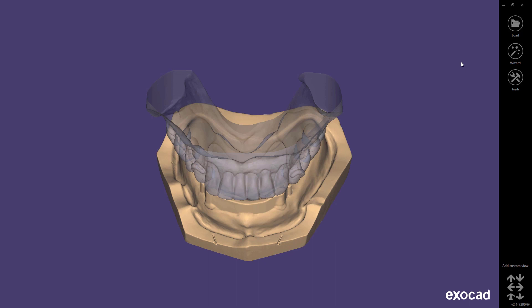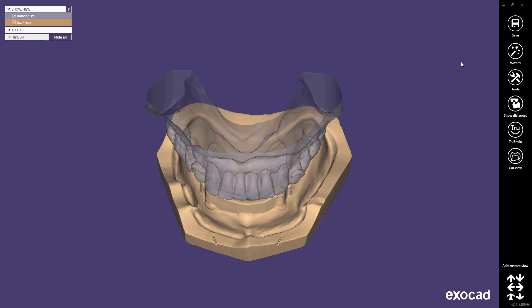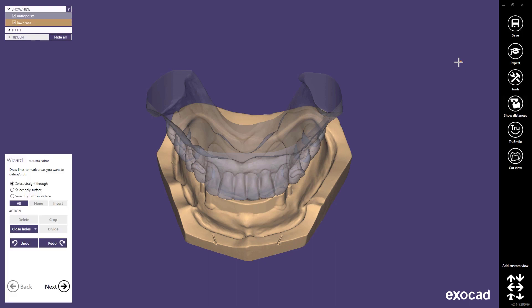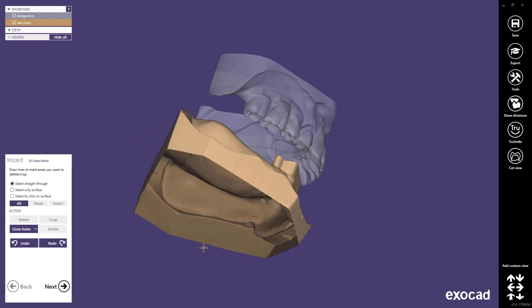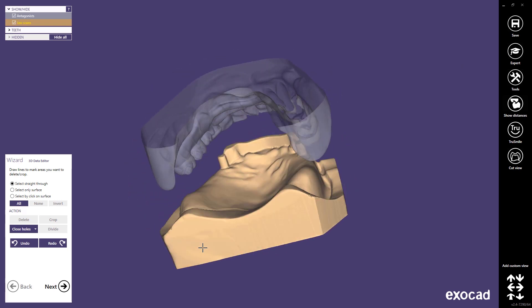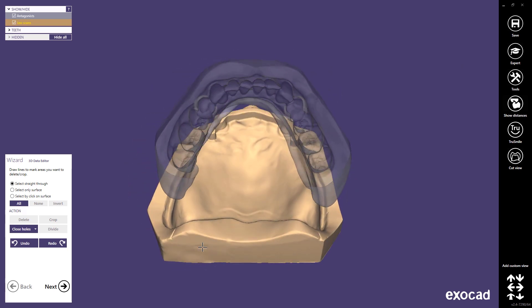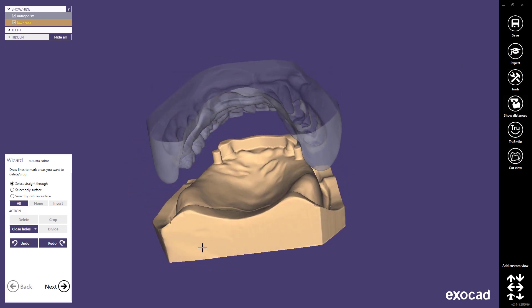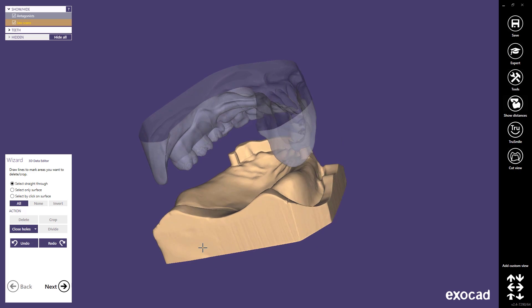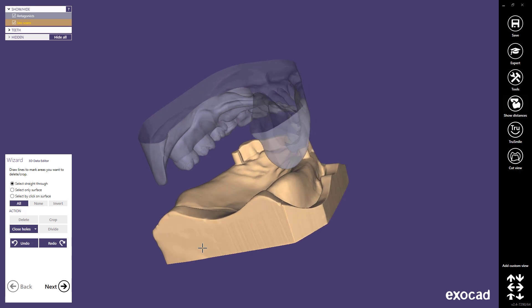The first step is a 3D data editor. The 3D data editor gives you the possibility to edit the scan data. In this case there is no need to edit the scan data, so please press next to go to the next design step.